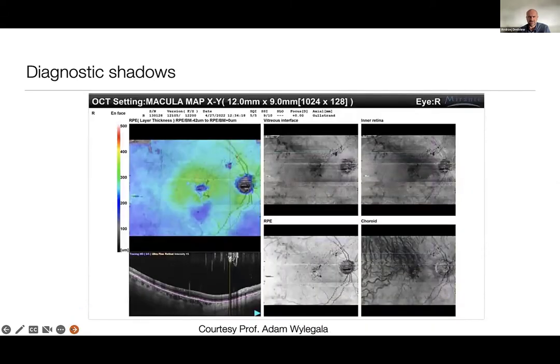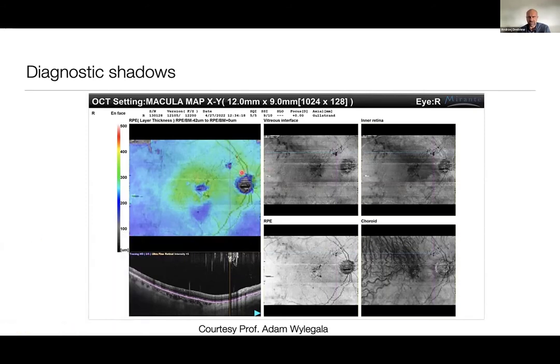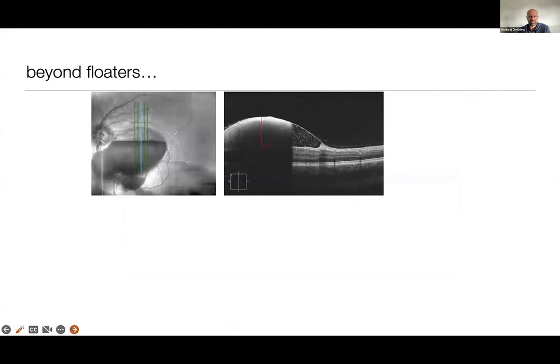Diagnostic shadows are something we see in floater patients on a regular basis, and in many cases their appearance is in front of the optic disc, so when we see that the floater is actually disabling the capability of the machine to measure the retinal fiber layer or see the macular scans, then obviously floater treatment really makes sense in terms of assessing the retinal function much better.